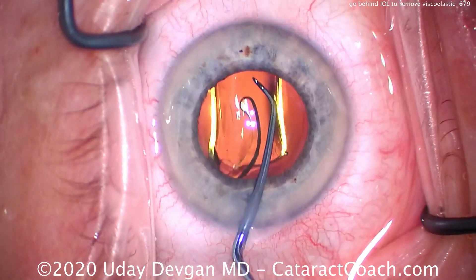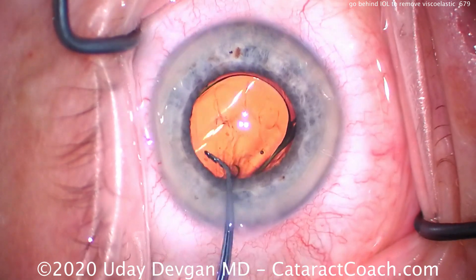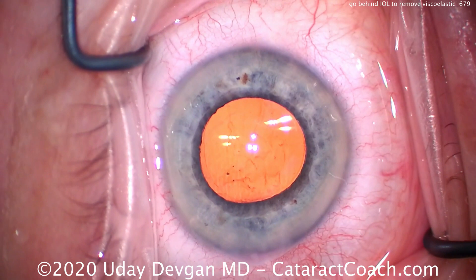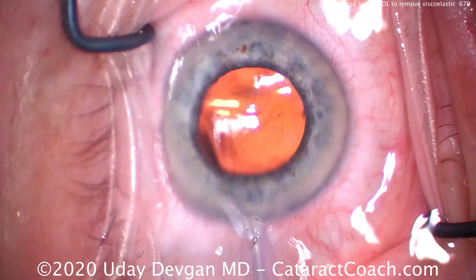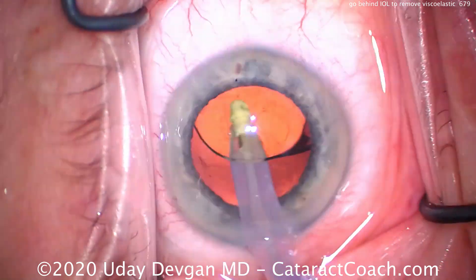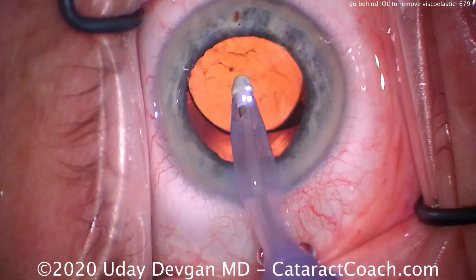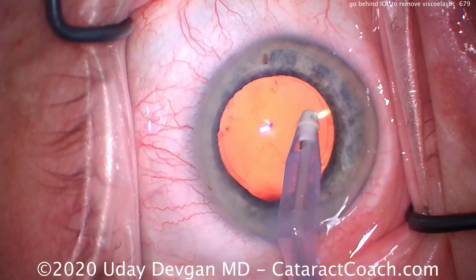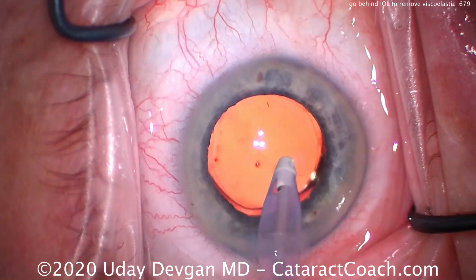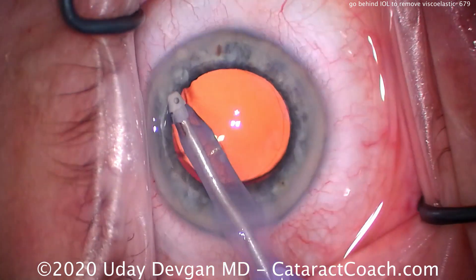We've got about a 5 or 5.5 mm diameter capsulorhexis, and that's a 6 mm optic. So do we need to actually go around the capsulorhexis and under the IOL optic to remove that viscoelastic? Notice how the IOL is lifted towards the apex of the cornea. Once we remove the viscoelastic from behind the IOL, we can clean up the anterior segment and remove the viscoelastic from the AC as well as the angle of the eye.